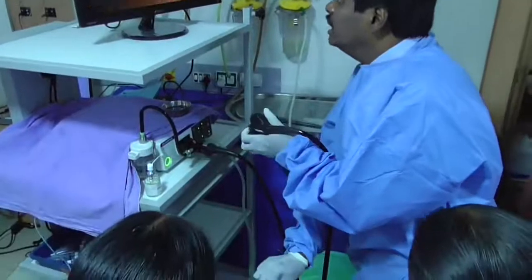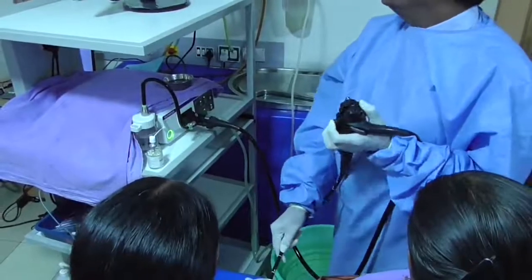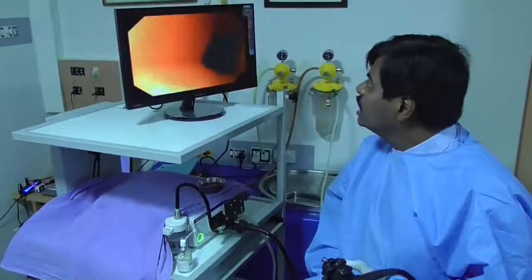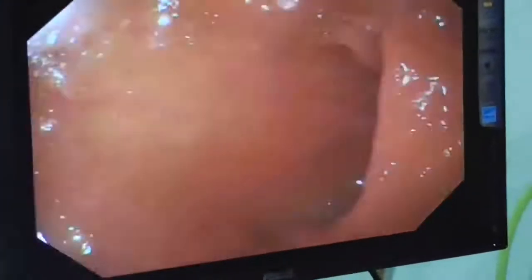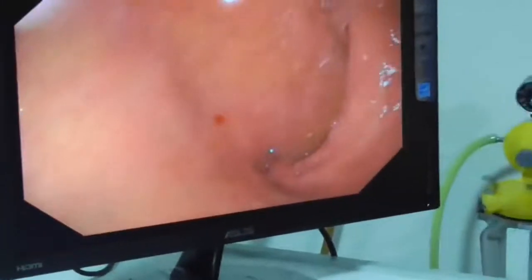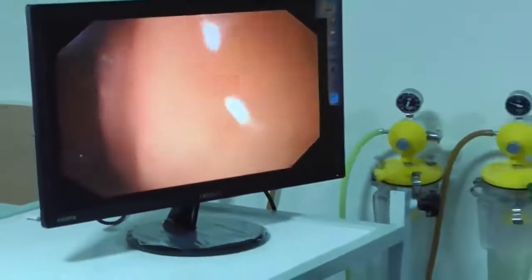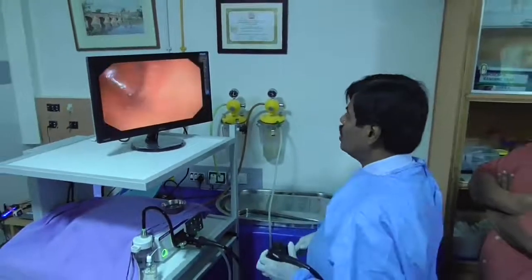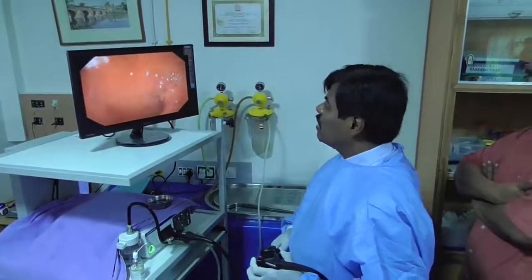As you pull further the scope drops by the short route back into D1 and through the pylorus. I gently bring it back to the antrum. In the antrum you can appreciate a minimal amount of redness indicating mild gastritis, and you can see the pylorus. If you haven't had a satisfactory view of D1, always re-enter and examine. This is the anterior wall of the duodenal bulb and this is the posterior wall — anterior at 9 o'clock, posterior at 3 o'clock. Turn your body to better appreciate each wall.